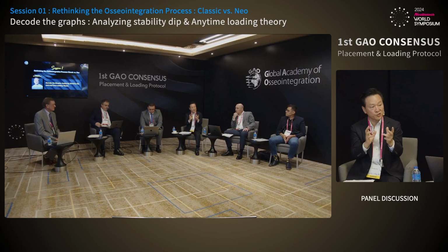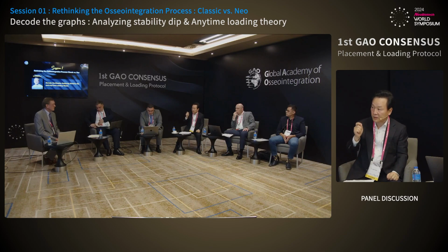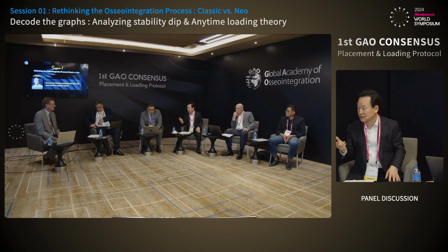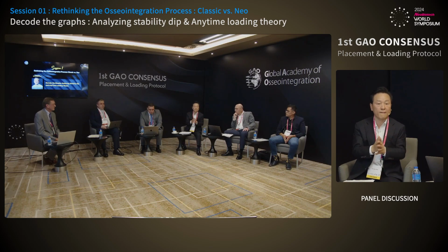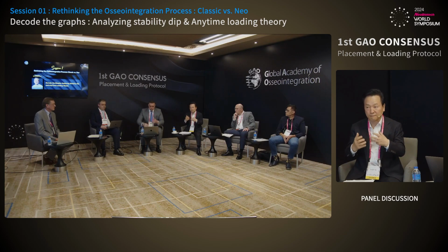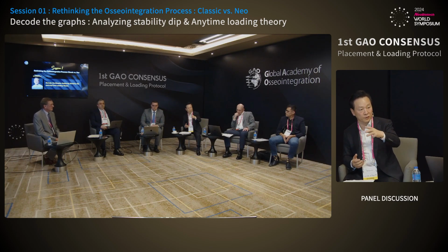The definition of immediate loading is that we load the implant within 1 week after we place it, right? Why do they limit the definition of immediate loading? Why not after 1 week, why not 1 day? They define immediate loading as within 1 week because they know the stability can change after 1 week. So we want to do everything, the prosthetic part, make the impression and deliver the prosthetic within 1 week, because nothing changes in 1 week. After 1 week, the body will do remodeling of the bone, then the implant will get loose. So before that, we want to do everything.